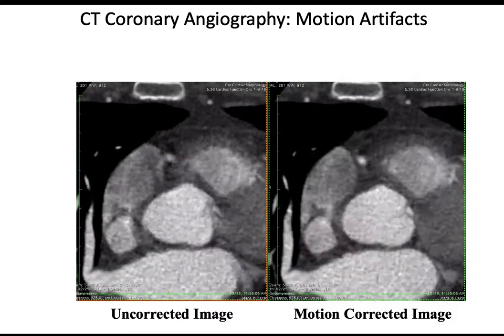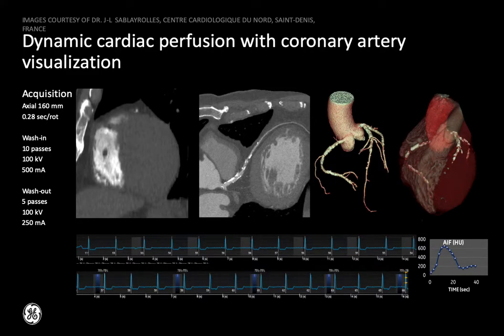Okay. So the second thing you can try to do is measure perfusion. I think this is supposed to be a movie, but we can try to get that up on the website. The idea here is that instead of waiting for the contrast to make it all the way into the coronaries and taking this picture, you actually plot how your myocardium's intensity is going up as the contrast goes into the myocardium. In theory, it's going to go down the coronary arteries, and then go into the capillaries, and it's going to stick around and come back out.